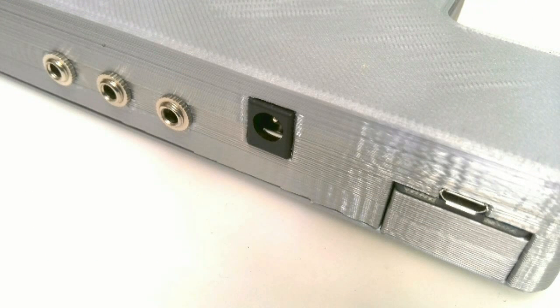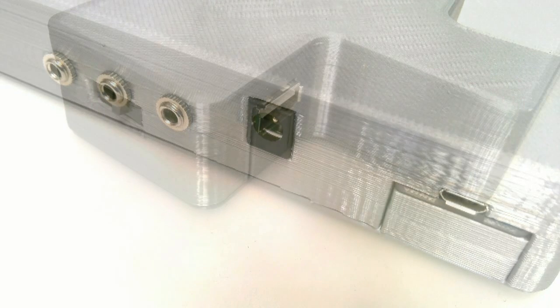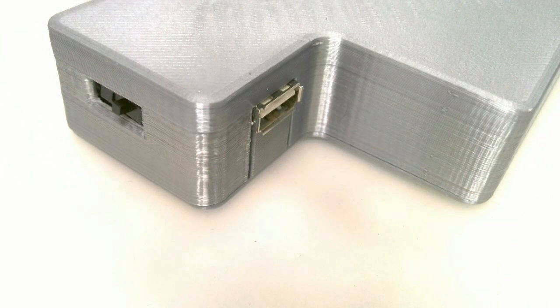Here's a view of the AT jacks, the barrel jack for charging, and the power boost input jack. Here's a view of the power switch and the output port for charging your iPhone or iPad while using the device.